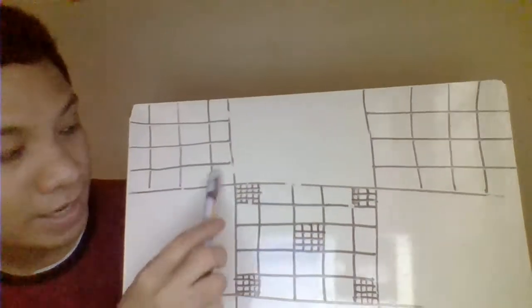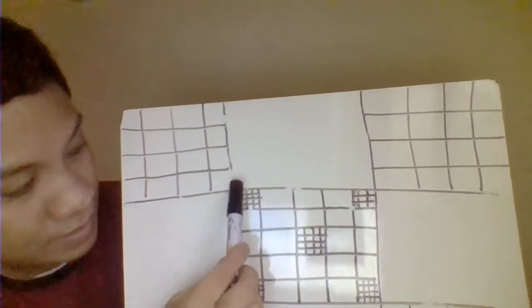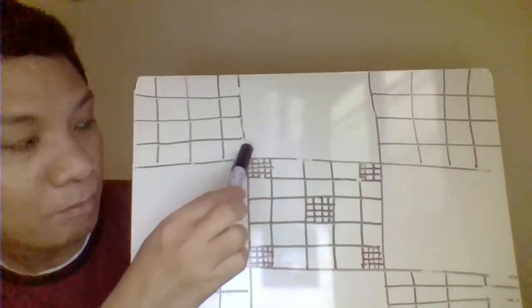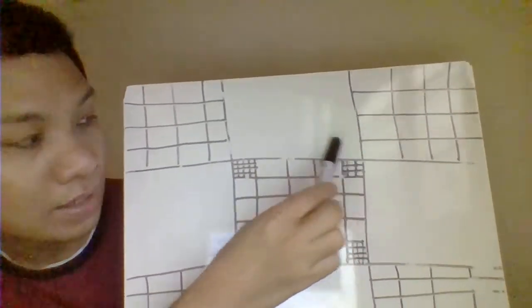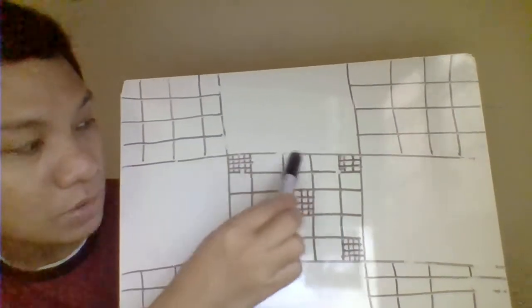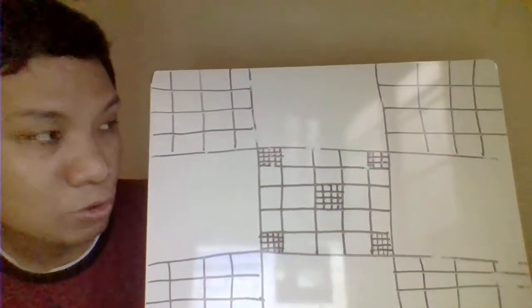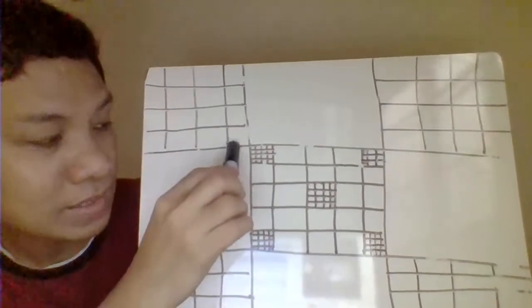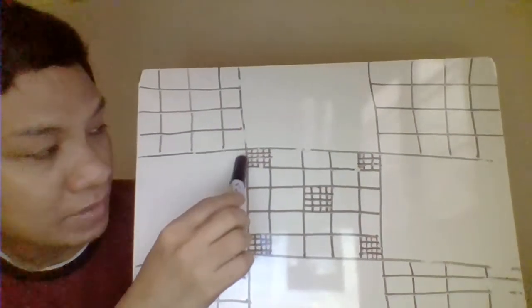Okay, so ito, isang ganyan. So, ang meaning to say, ang ating length, from this area papunta dito, that's 0.2 millimeter. Paano ulit ng 0.2? Because mula dito papunta dito is 1 millimeter, and however you divide it by 1, 2, 3, 4, 5, so that's 1 over 5, that gives you your 0.2 millimeter. Ang width natin, ganun pa din. Since it's also 1 millimeter, 1, 2, 3, 4, 5, so 5, isang ganyan. Also 0.2 millimeter.